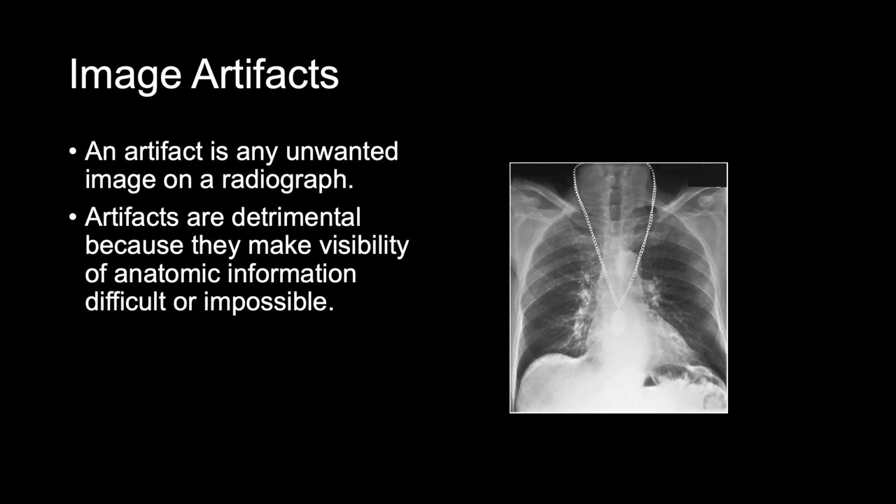An artifact is any unwanted image on a radiograph. Artifacts are detrimental to radiographs because they can make visibility of anatomy, a pathologic condition, or patient identification information difficult or impossible to see. They decrease the overall quality of the radiographic image. Various methods are used to classify artifacts.